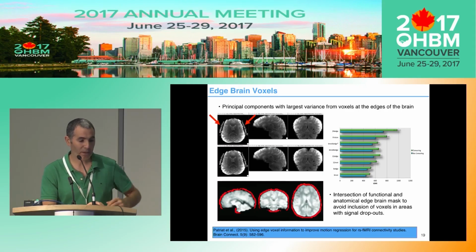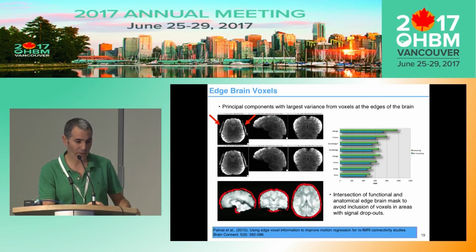Another possibility could be to use the principal components based on the voxels that are in the edges of the brain.